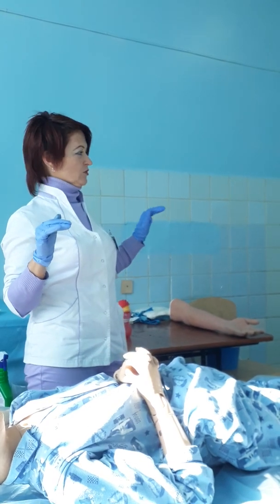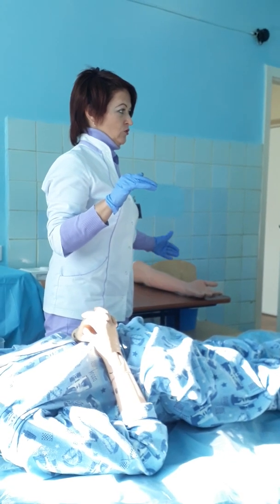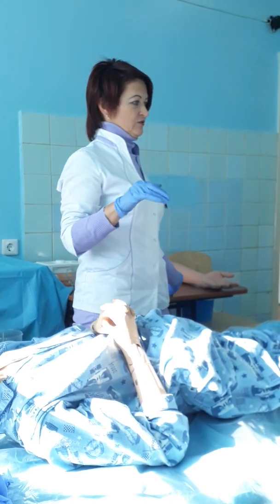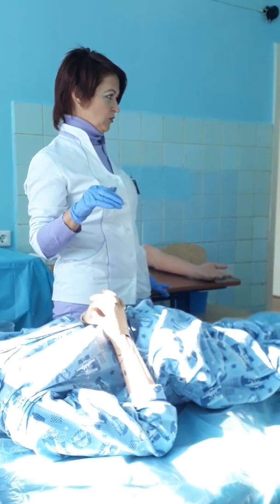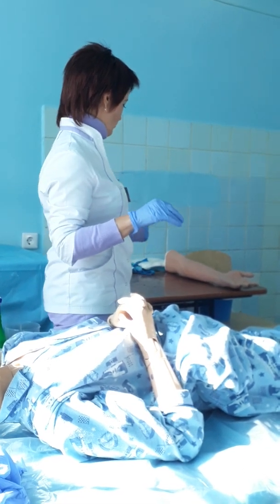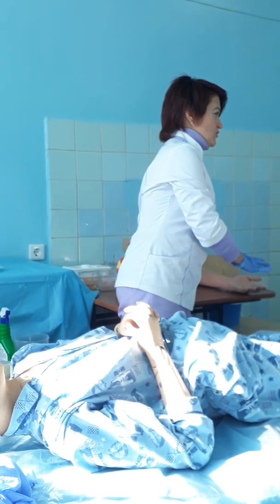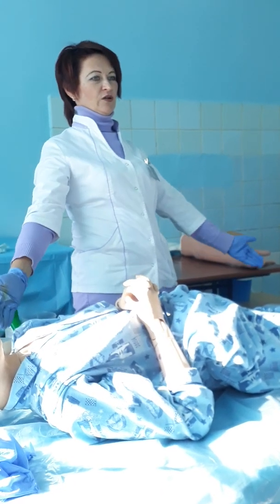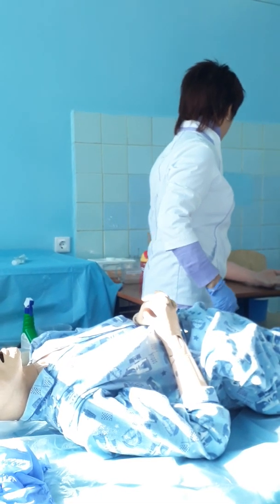Afterwards you explain the position. What position may be used for this manipulation? On the table. Yes, if your patient can do it, they can sit on a chair, and for intravenous injection you need a special table in your treatment room, a special table for intravenous injection. It must be a different table. One table for disinfection, and an absolutely different table for intravenous injection. Or your patient can lie on the bed in a relaxed position. It's your decision how you will do it.